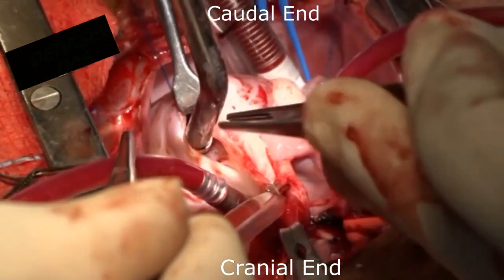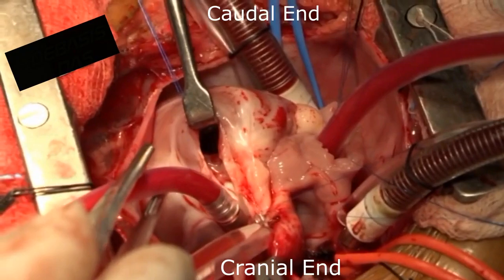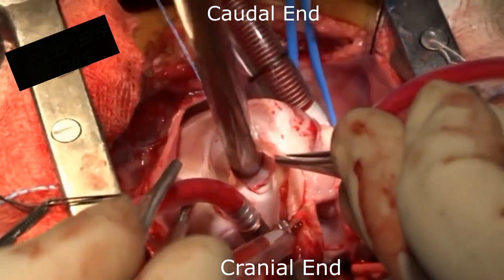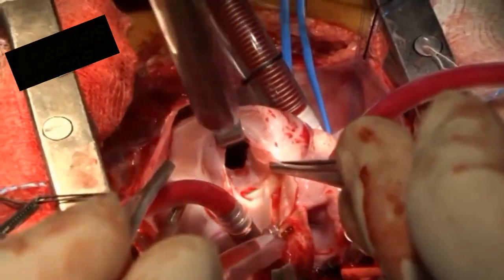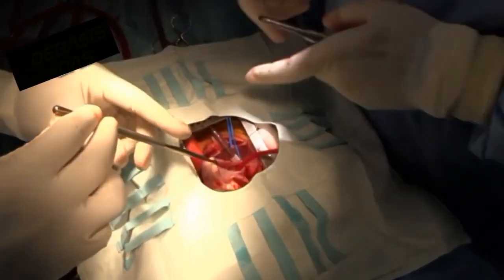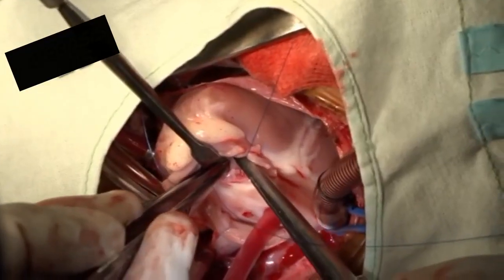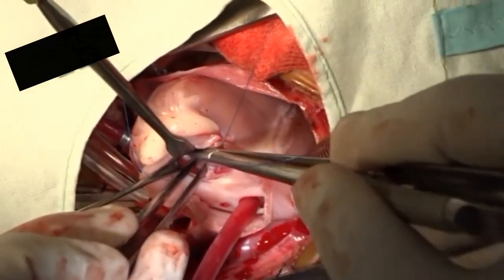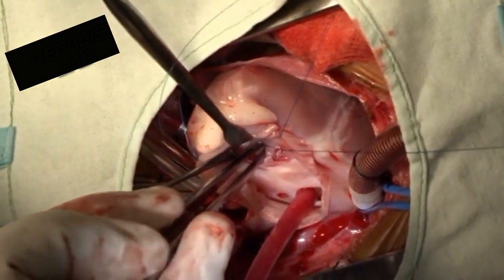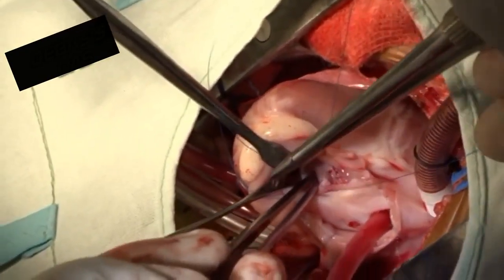Any further muscle bundles are resected and the RVOT is assessed visually as well as with an appropriately sized Hegar dilator to see whether the RVOT is open or not. The next step is VSD closure. The VSD in a tetralogy of Fallot is a large non-restrictive VSD and our choice of VSD closure is interrupted 5-0 polypropylene pledgeted sutures.